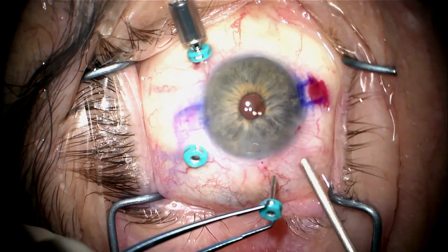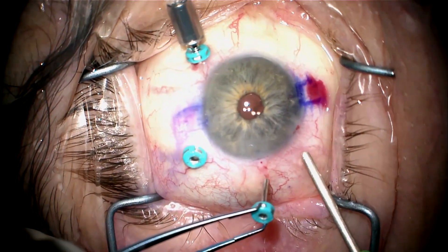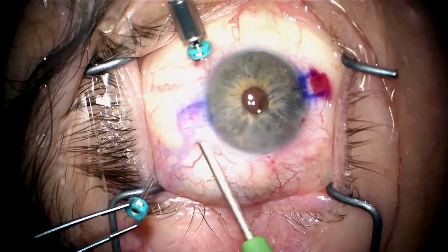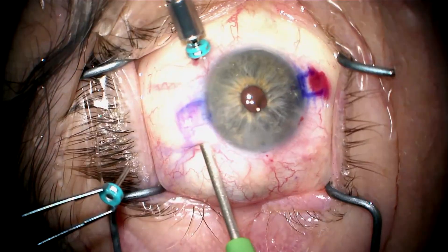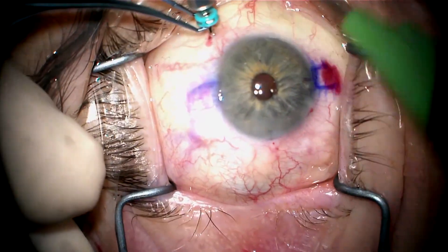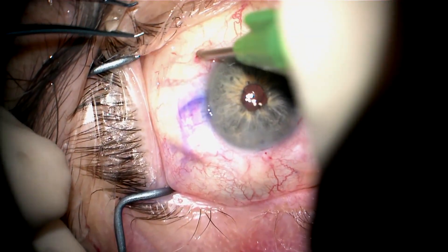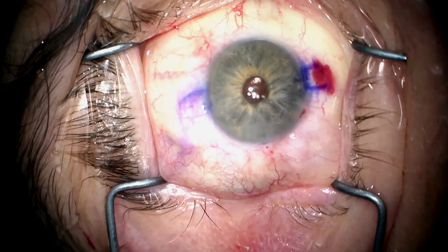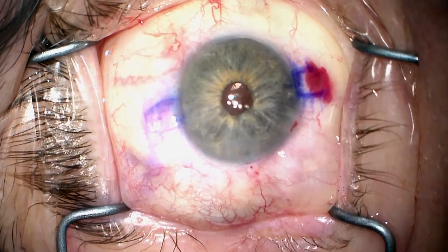The case is completed now. I'm removing my trocars and doing a little cautery to seal this area so there won't be any leakage. I push the conjunctiva against the globe and cauterize right there to create a little scarring in that area, and the case is completed. Thank you for your attention.